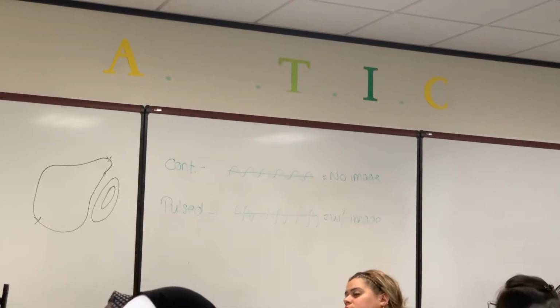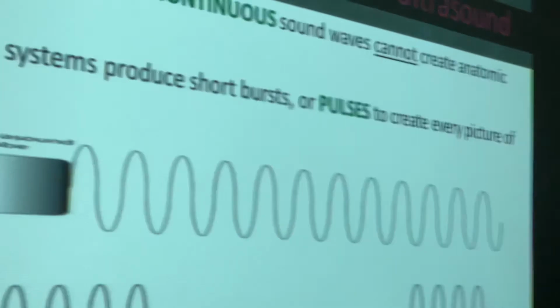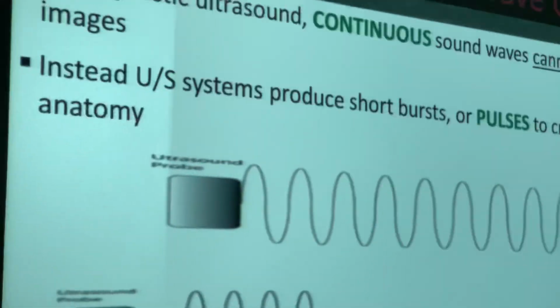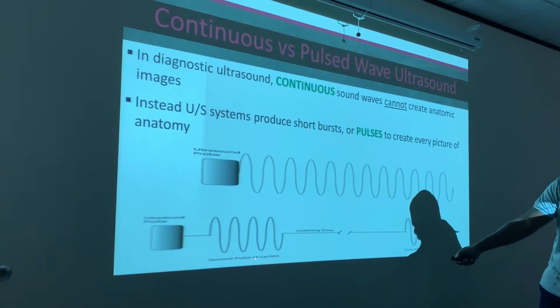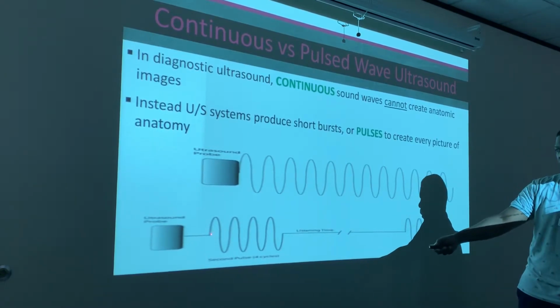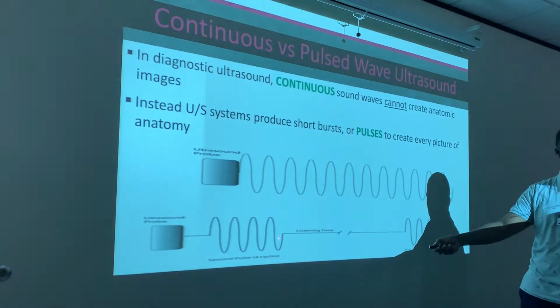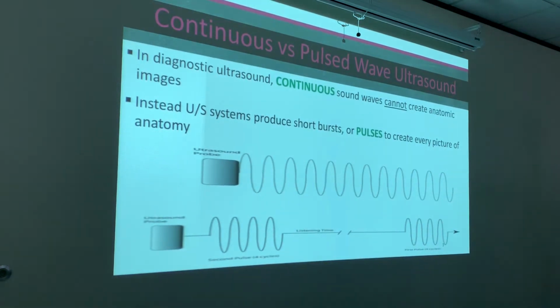Like this one here, it's 4, right? Absolutely. So guys, let's count these up, because it says it right on the bottom. I'm sorry I stretched the image out so much, but I was trying to make it big enough for us to see. You see right here it says cycles per pulse is 4. So we're going to start at the very beginning. Up, down, that's 1, 2, 3, 4. That's 4 cycles in that pulse. Okay? We got that, guys?